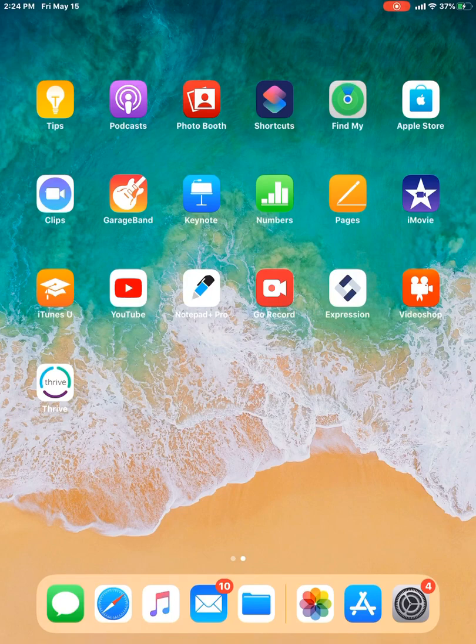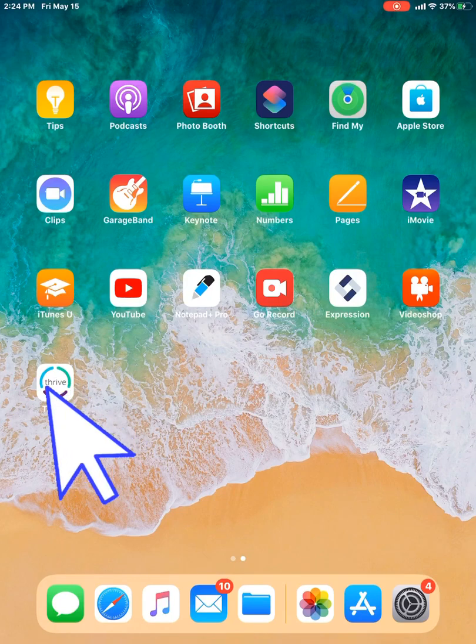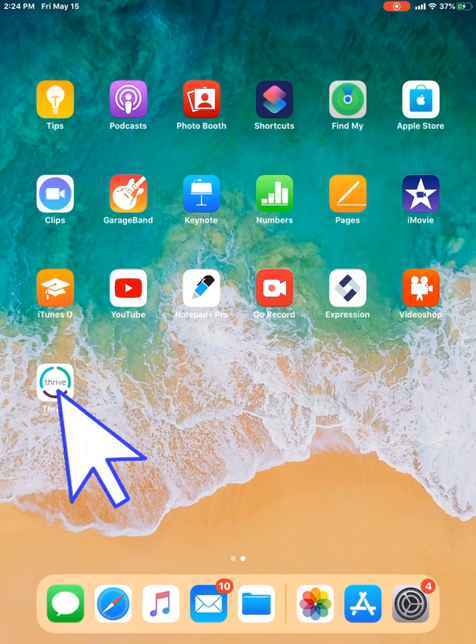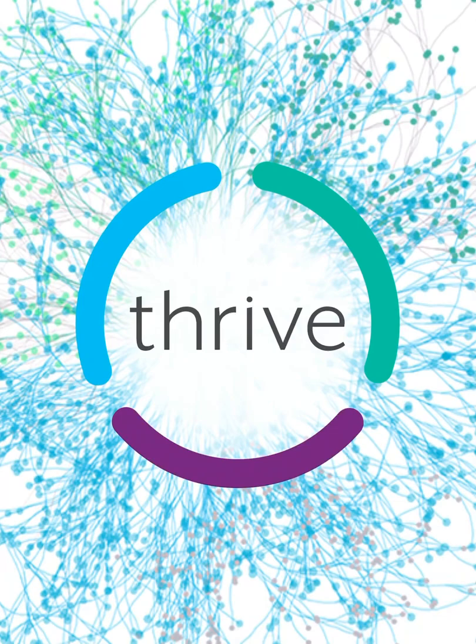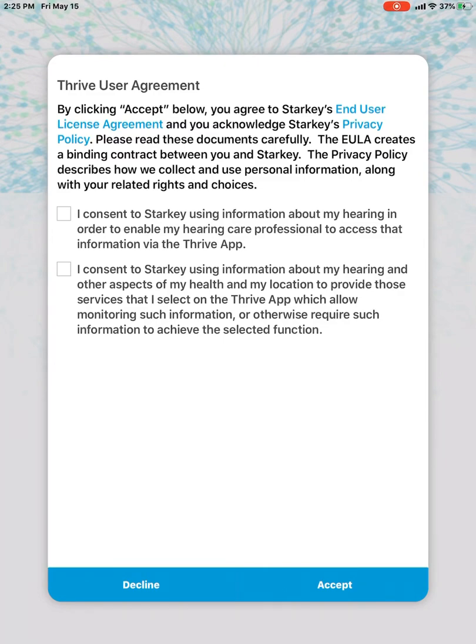So I'm going to tap on that Thrive app. And it prompts me the first thing to accept the Thrive user agreement. If you'd like more information on Starkey's policies for the Thrive app, what they're doing with your information, you can tap on that end user licensing agreement or the privacy policy.